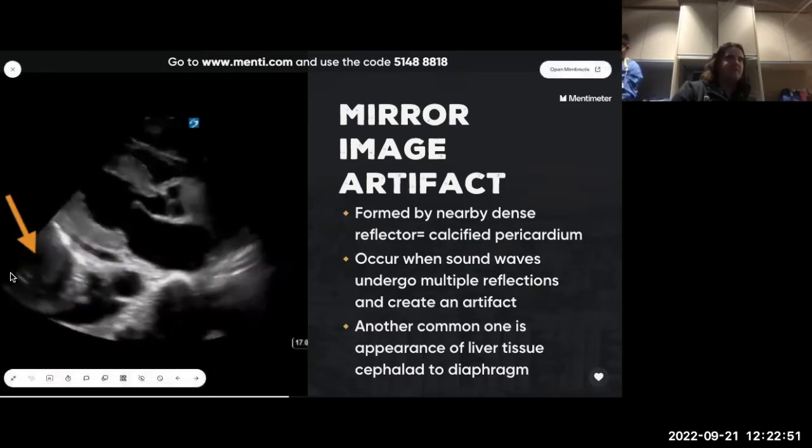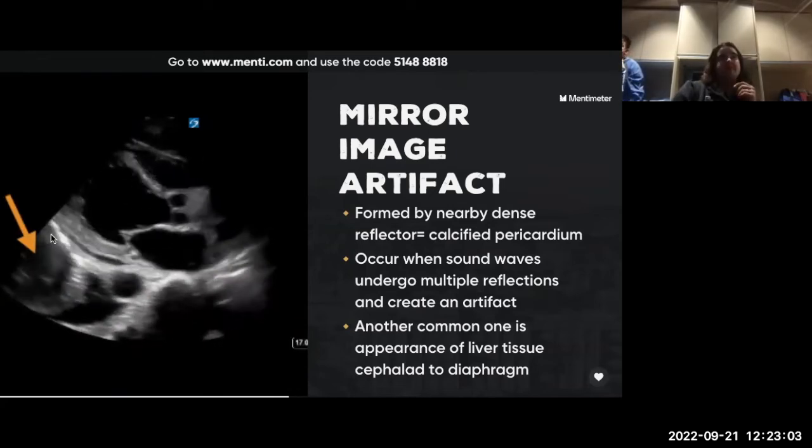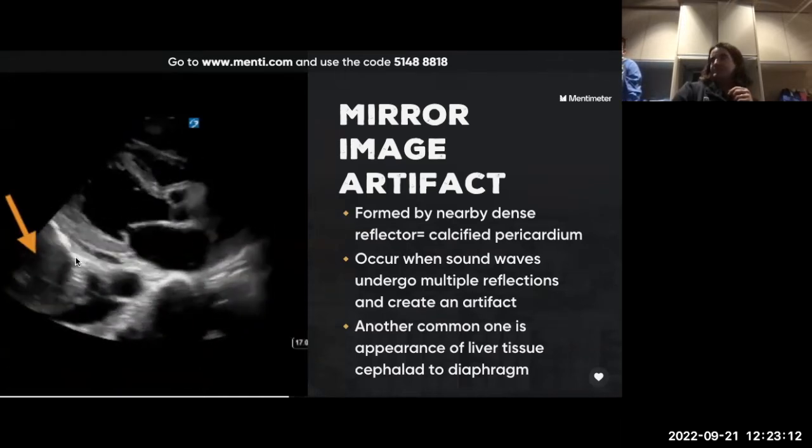You can tell, obviously, that this looks like myocardium. But of course, there probably actually is a pleural effusion, so both can be true. Any questions on that? Wherever you see bright, thin objects, like I said, the pericardium or the diaphragm, or even some parts of the heart, just be very leery that mirror images can show up.